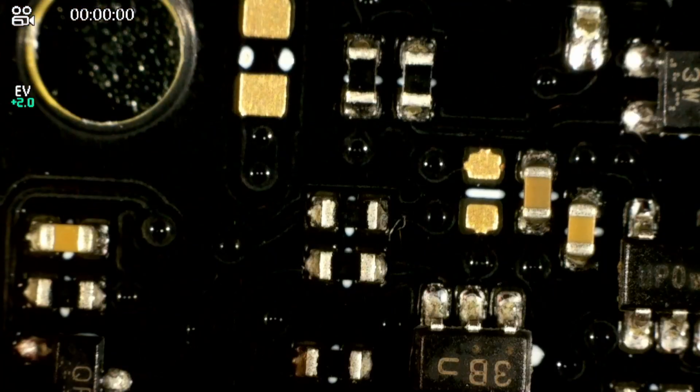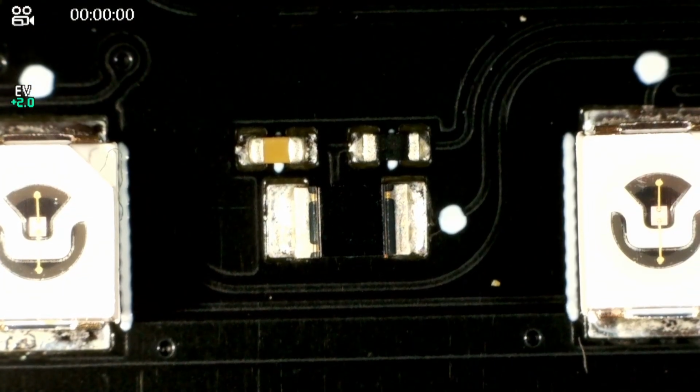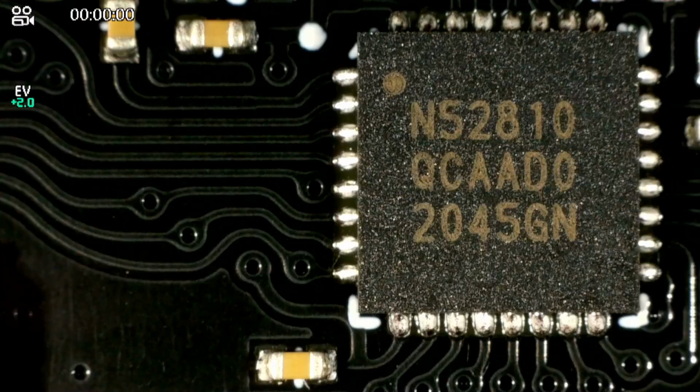Yeah, I think it's really simple otherwise, and I think the structure is very similar to one of those electronic pregnancy test readers, except that the electronic pregnancy test ones do not have this portion. I think this is an extra step because of the importance of a test like this. So yeah, pretty cool. We should take a look at the optics for a second.